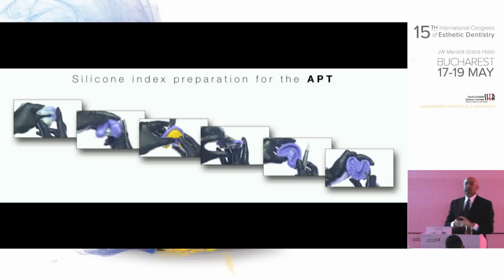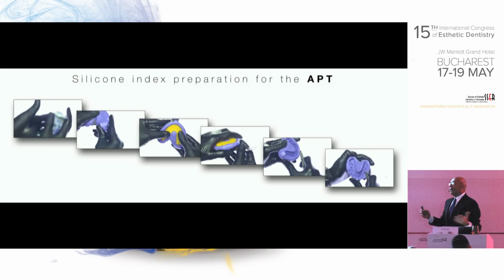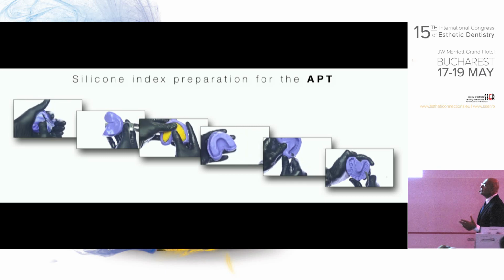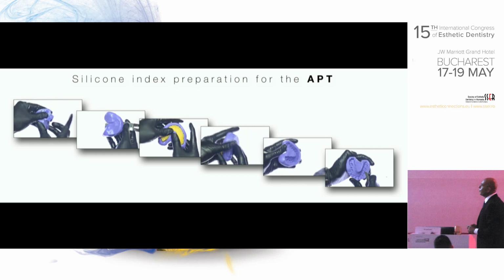And if you say, I don't have a printer, almost every lab has a printer. So you can send this STL file wherever you want and they will print it for you.